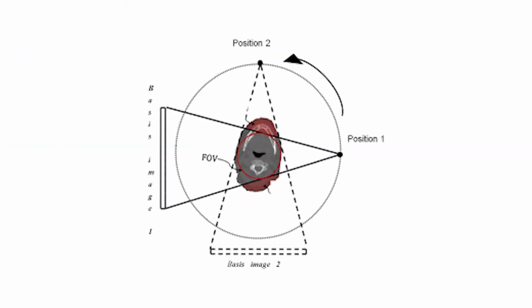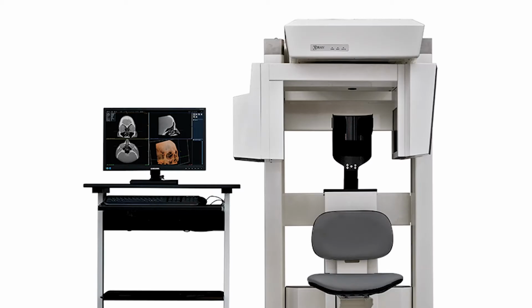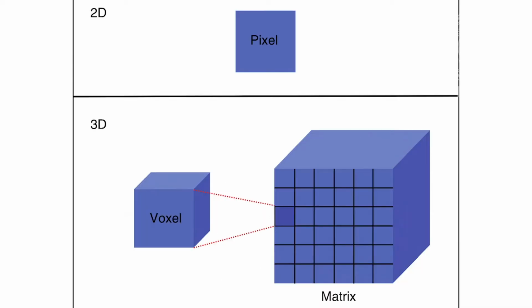The CBCT scanner rotates around the patient's head, obtaining nearly 150 to 600 distinct images. A single 200-degree rotation over the region of interest acquires a volumetric data set. The scanning software collects the data and reconstructs it, producing what is termed a digital volume composed of three-dimensional voxels of anatomical data that can then be manipulated and visualized with specialized software.